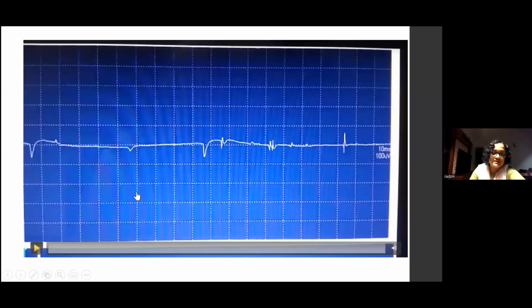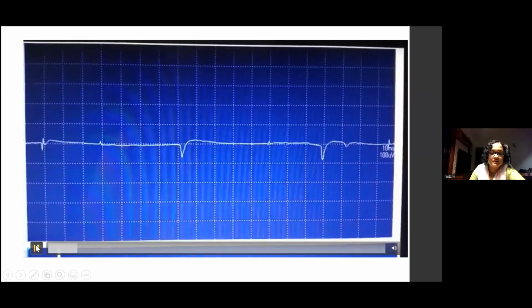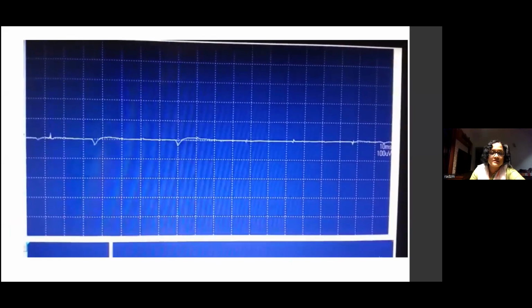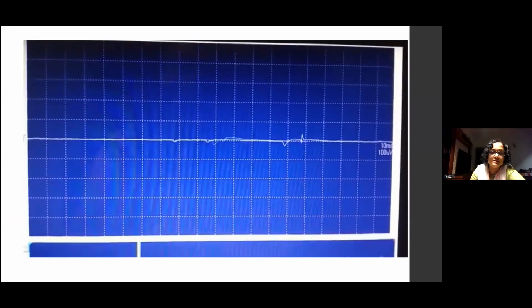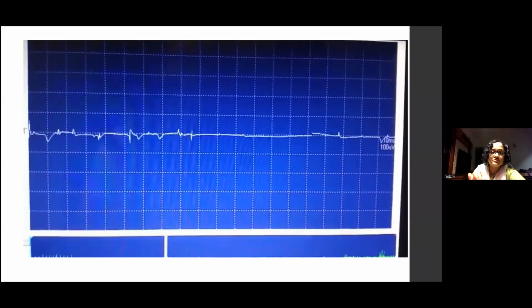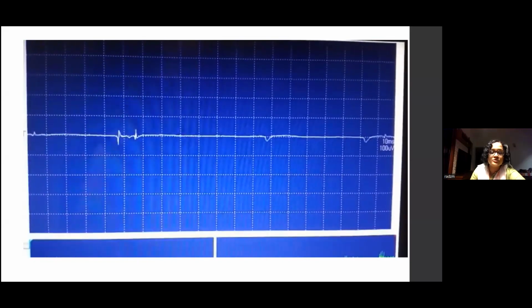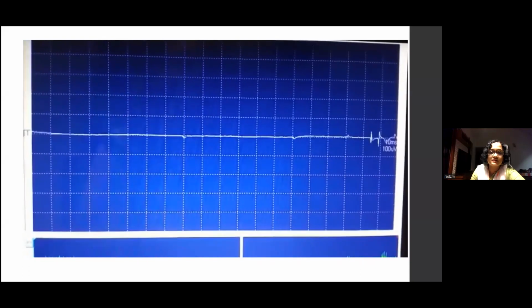In this video, you can see the positive sharp waves here already, and these are the fibrillations. You can see the positive first and then negative up. The sound is very high frequency, it's very tinny, like rain on a tin roof. Those are the words that are usually used to describe these things.